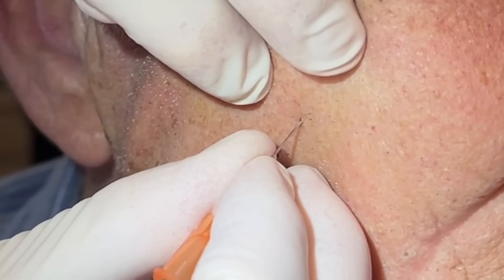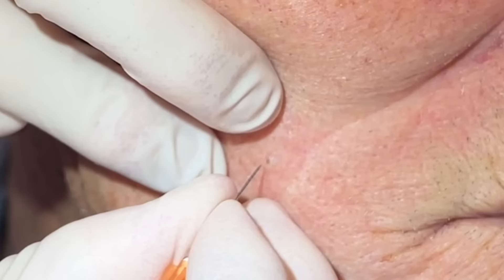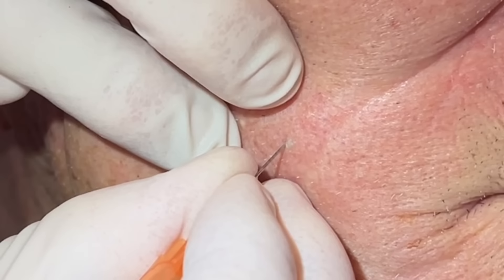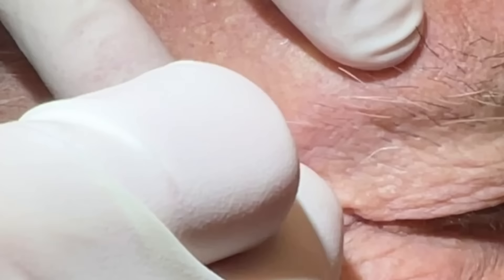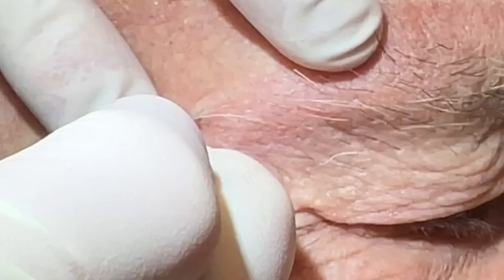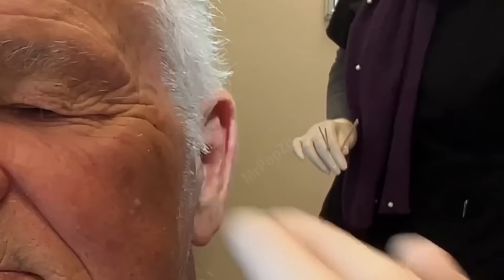On the blackheads, all I do is use a small tip of a needle here. On the whiteheads, they're not open to the surface, so we use a sharper tip of the 11 blade. A little poke on that one, sorry. And down here we have one — a little pinch on that one, sorry. So if I'm squeezing too hard, you let me know as we go. Does have one right by the eye there — we'll do that last.